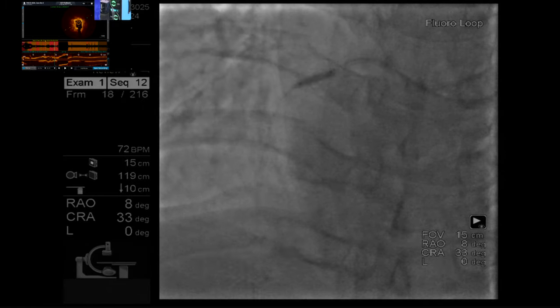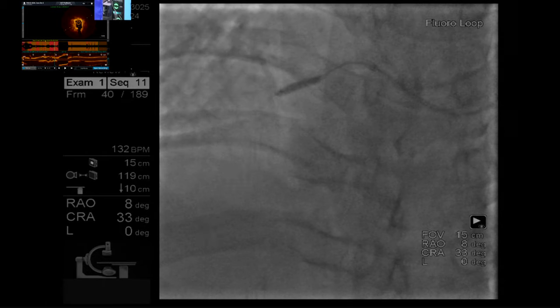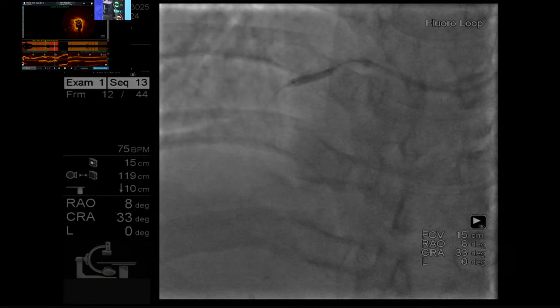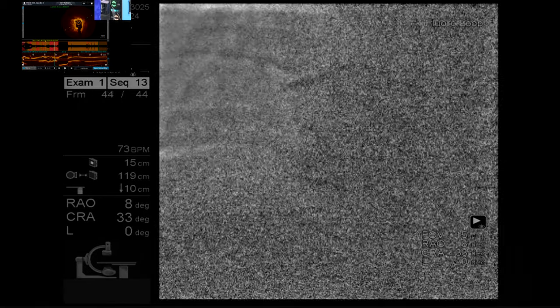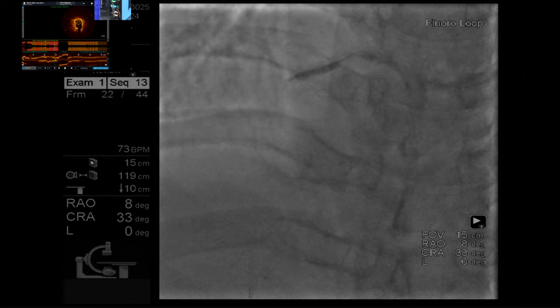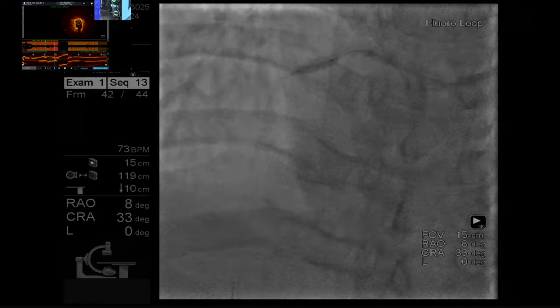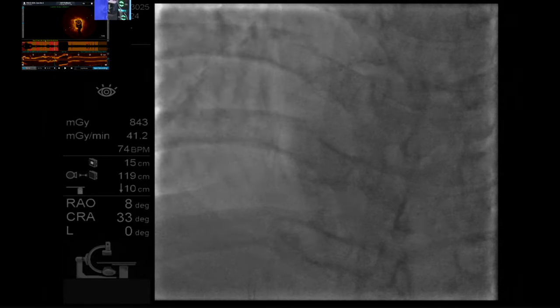Okay. I think Dr. Tejas, this is Dr. Girish here from Bangalore. Yeah, how are you, Girish? Very fine, sir. I just wanted to see, OCT, the greatest advantage is you know where to deliver your pulses maximum. Yes, that's true. So I am embarking upon both the nodules to finish them completely. Are you able to hear?